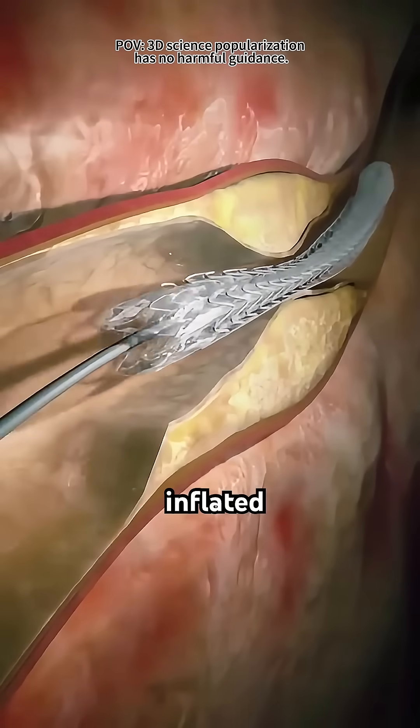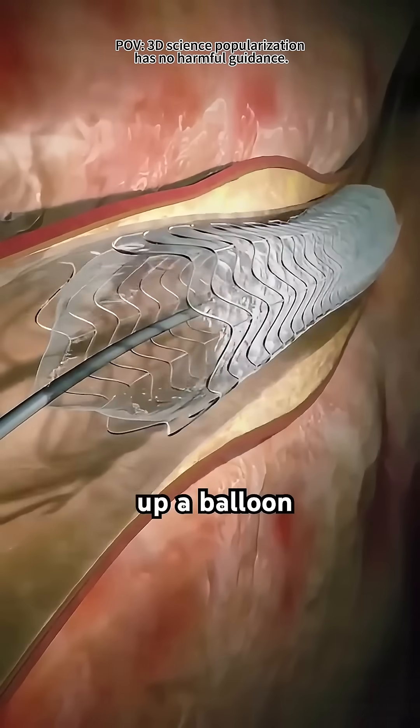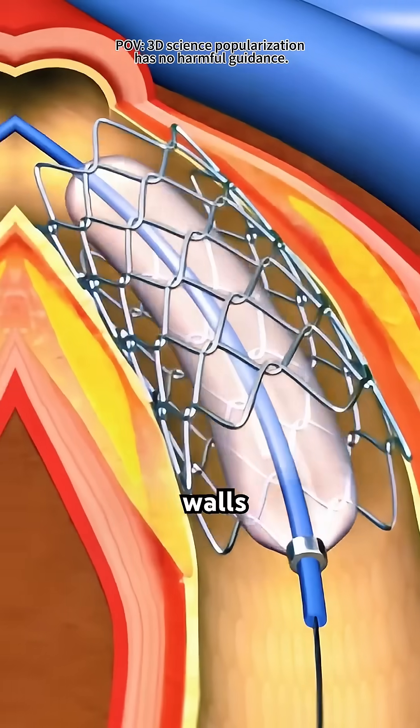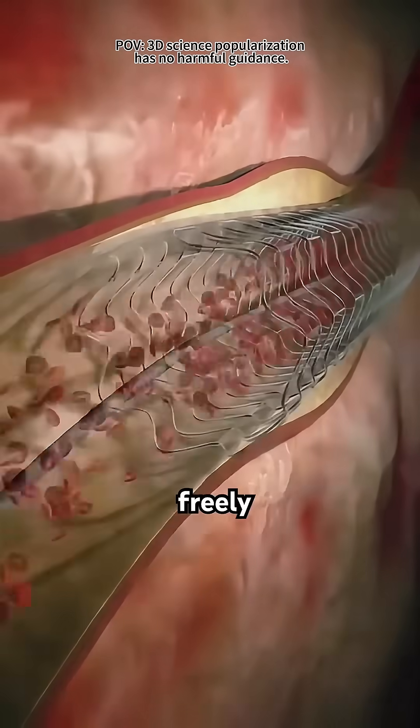Once it's in place, a tiny balloon at the tip is gently inflated, almost like blowing up a balloon inside your artery. That balloon presses the built-up plaque against the artery walls, clearing the way for blood to flow freely again.